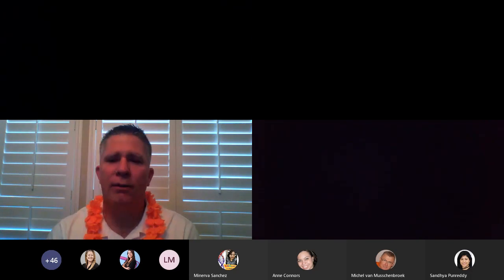Super. Any further questions? We'll be on for another 5 minutes monitoring the chat if there are no more questions, and we'll just answer the questions in the chat.